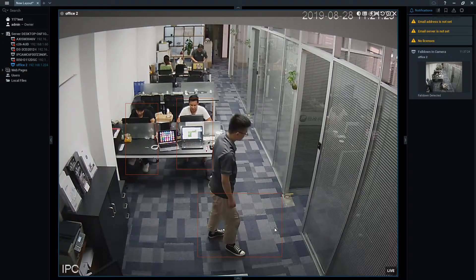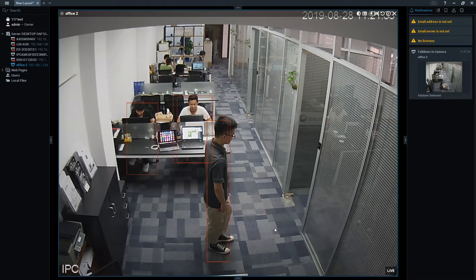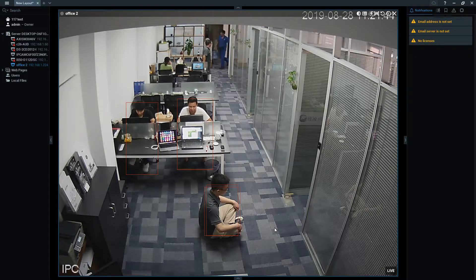The next thing we want to show is what if a patient or person sits on the floor. It is not falling — he is just sitting on the floor. Notice there is no alarm that goes off because he is sitting, not falling. Our algorithm is very accurate at identifying the difference.